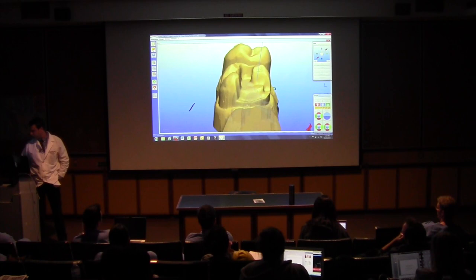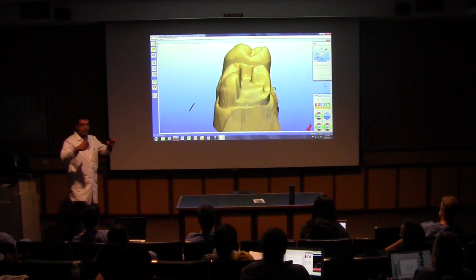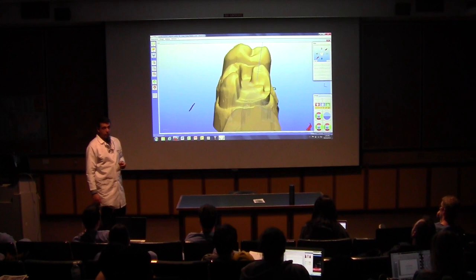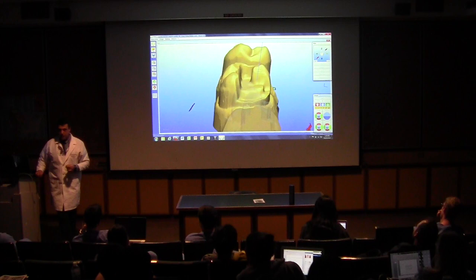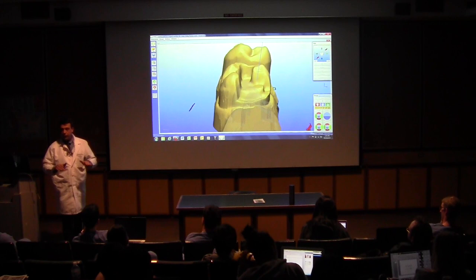More of a laser point here. Do you see the divergence right here? Do you see the internal line angles that are rounded? Right over here, right over here, right over there. Is this a good prep? Yeah. Why do you want to avoid sharp internal line angles? Fracture, right? Stress concentration in one spot, you don't want that. Everything's rounded and smooth, like a toboggan, smooth and rounded, okay?